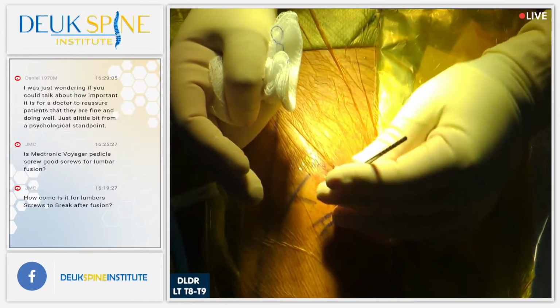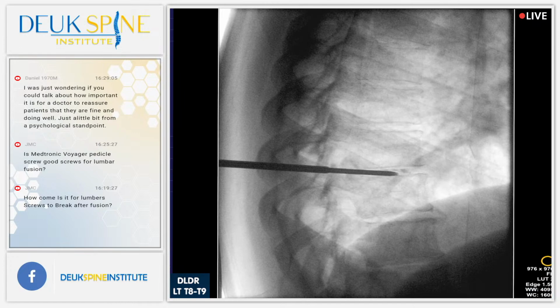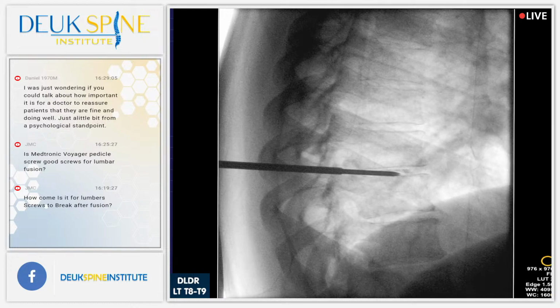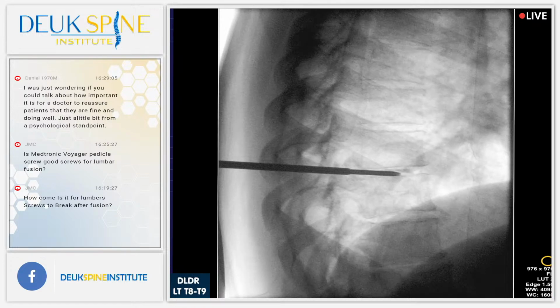But the point is, this is a very tiny incision. And everything's going well. I'm now feeling the back of the disc, or close to it. That's probably the facet. I have to get past it. I feel the herniation. We're inside.